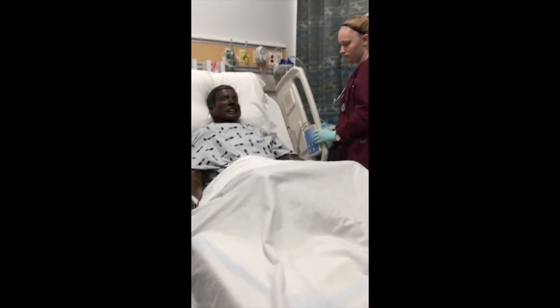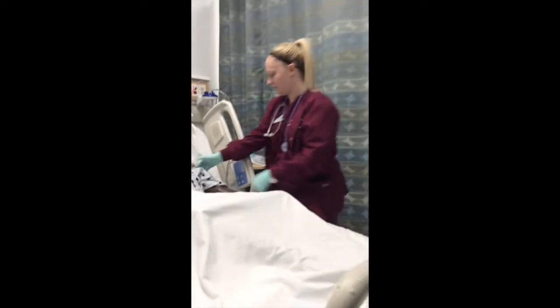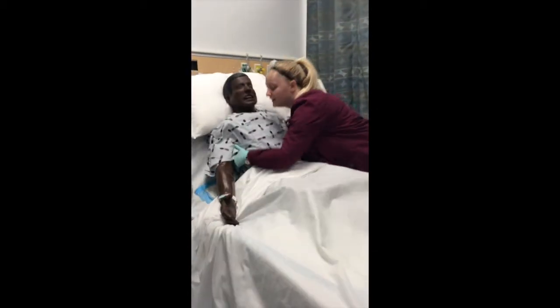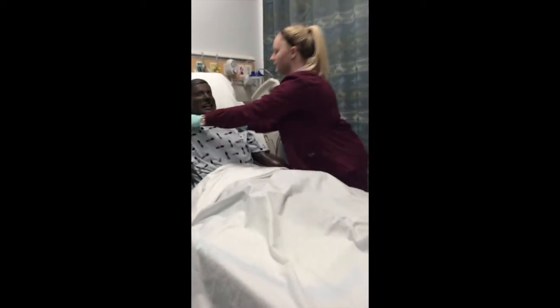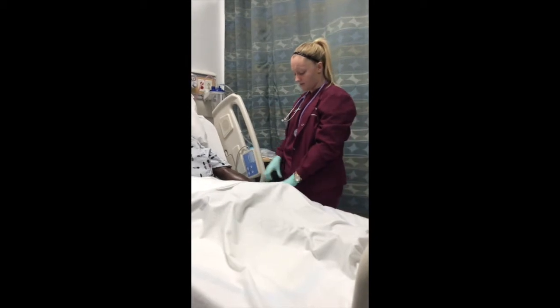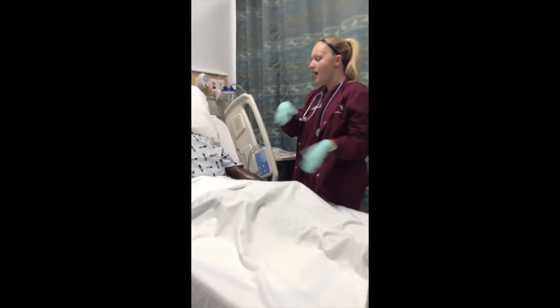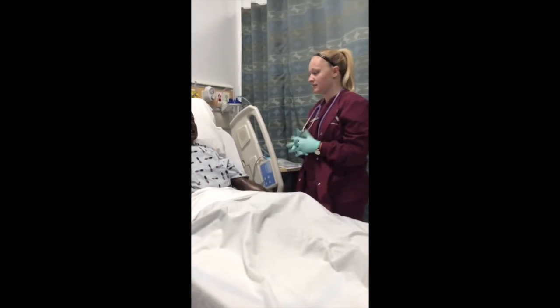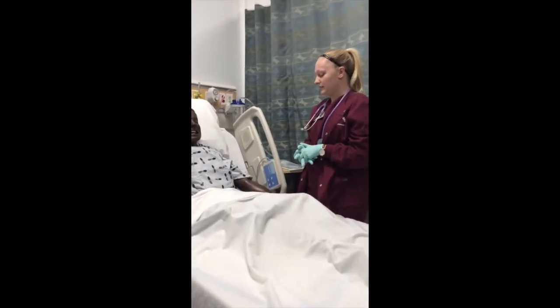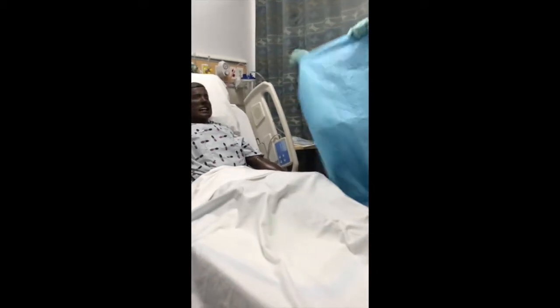Alrighty, I'm going to go ahead and make sure the patient's sitting up in bed really good and high. If they're able to take the cup, I'm going to go ahead and have them take the cup with water so they know that they're going to be taking drinks out of it. I might have them take a couple drinks and moisten their mucous membranes. Then I'm going to go ahead and get my chux pad and place it on them.